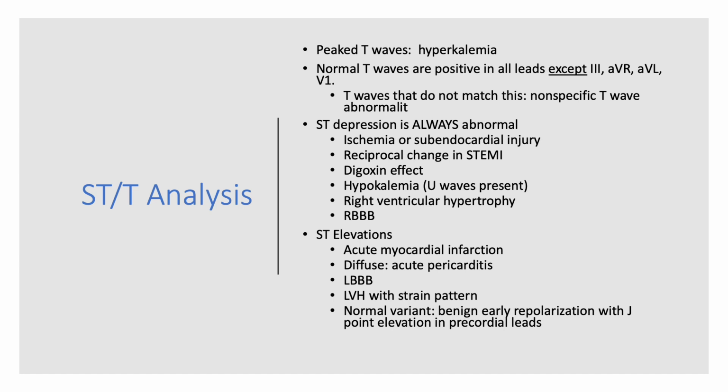ST depression is always abnormal. It typically means ischemia or subendocardial injury. It could also mean reciprocal change in the setting of an ST elevation MI. So for example, if I had anterior ST elevation MI, I might see ST depression in the inferior leads that are reciprocal change. You could also see ST depression with digoxin, hypokalemia.